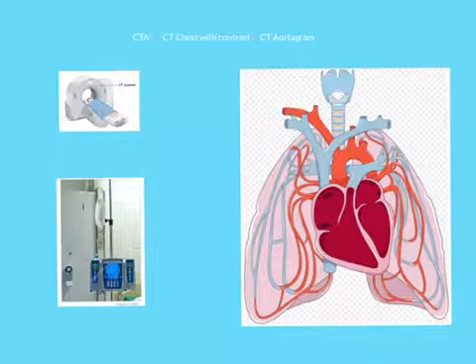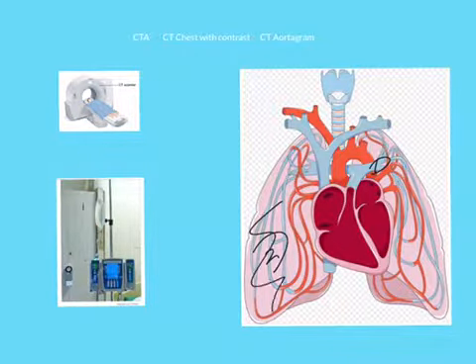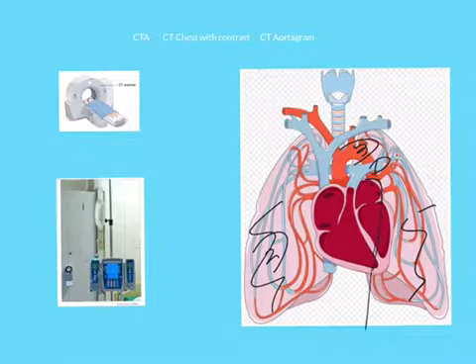There are only really three areas of the lungs that we're concerned about when we're imaging with a CT scan. The first would be the area of the pulmonary arteries right over here. The second would be the area of the lung parenchyma over here and over here. And the third would be the aorta, which is over here and then runs down behind the back of the lung.